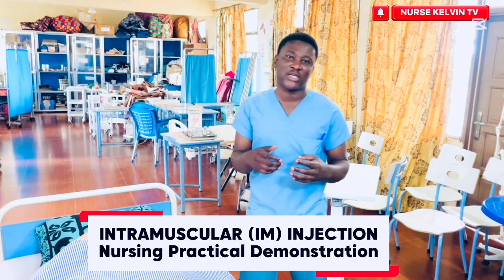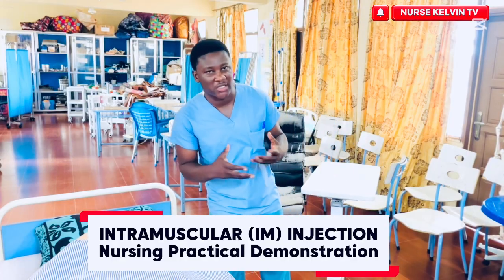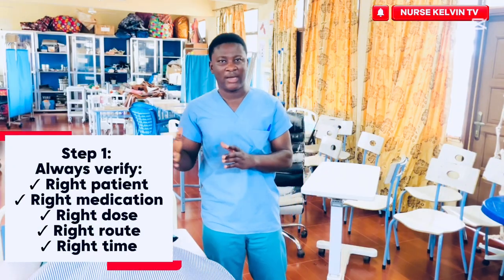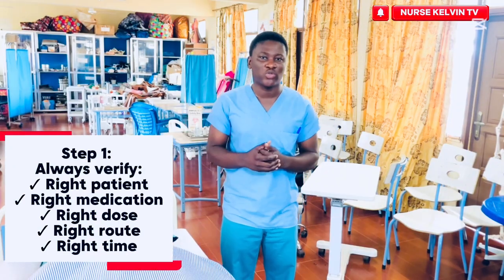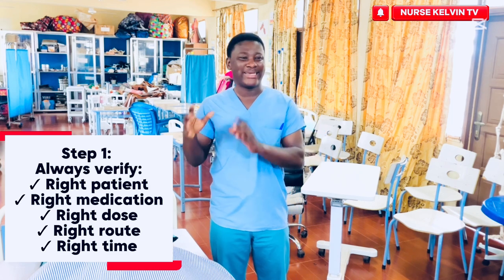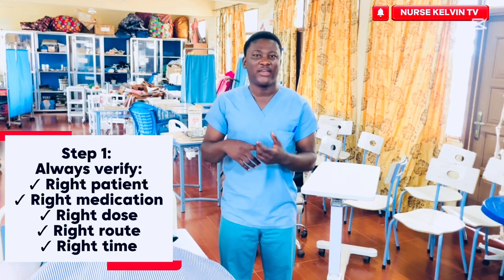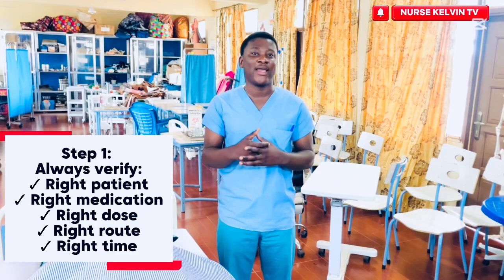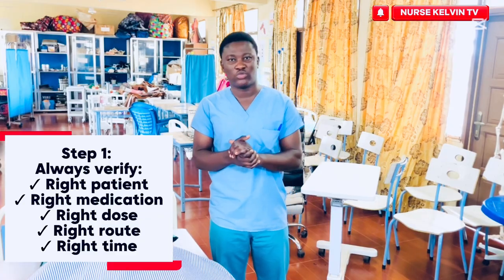Before you start, you need to first check and see whether the time is due for you to administer that medication for the patient. You need to also identify the right patient, the right drug that you are supposed to give, then the route, then the time, and everything that you are supposed to do for the patient.